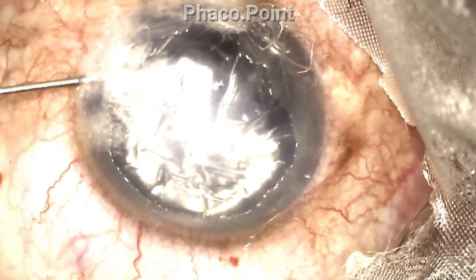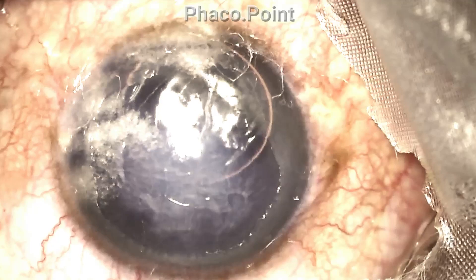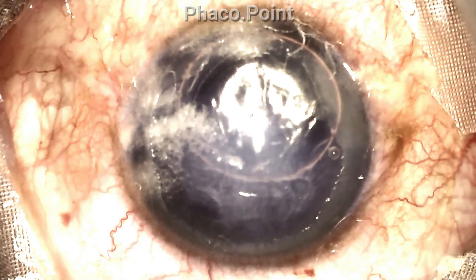At the end of a few minutes, we did end up losing a little bit of air from the anterior chamber; however, we were able to achieve some amount of clearing of the cornea. Since at this sitting I needed to perform a second injection, I chose now to use 14% C3F8.